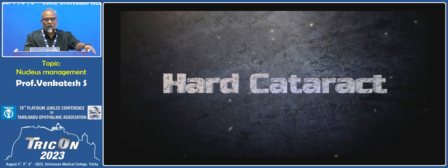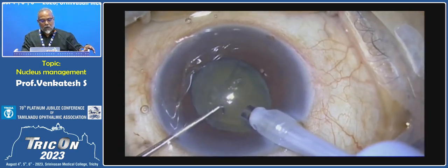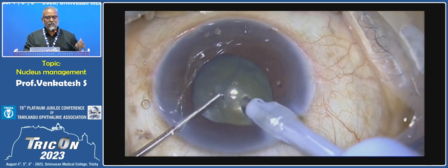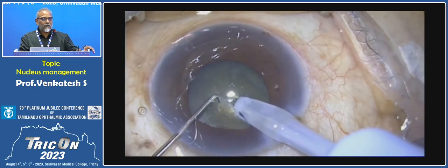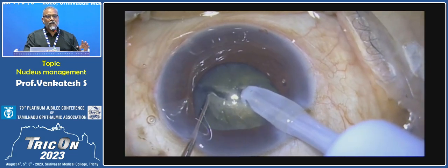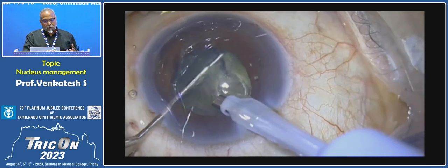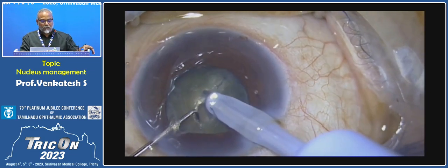When it comes to harder grades of cataract, the technique of choice would be a direct phaco chop. However, you can also do a stop and chop, but a lot of energy will be utilized for this. Now, there is a reason why the lens is called the crystalline lens, because it is crystalline in nature. It has intrinsic fracture zones because of the creation of the lens as such, because the various sutures in the lens create multiple fracture zones.